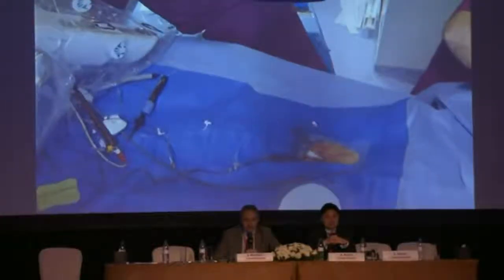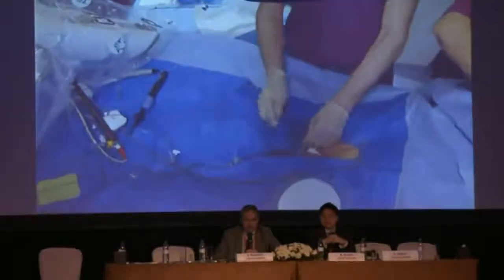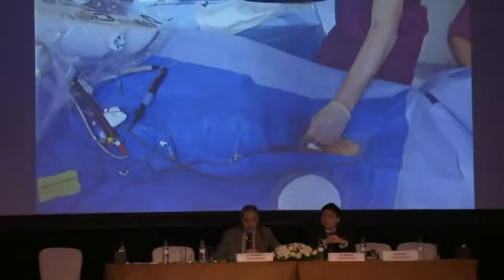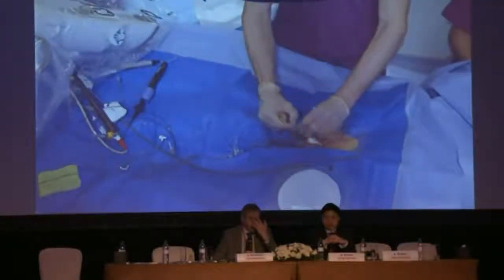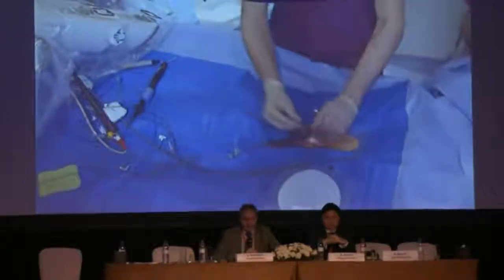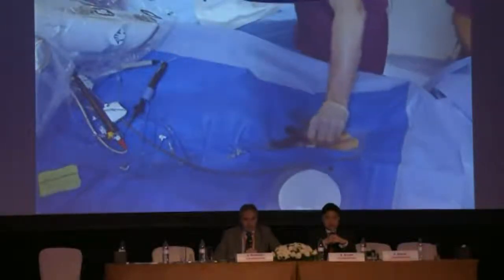And I would generally just try and characterize the areas that were really fast and ablate them as I go along. So I'd look for those type 1 electrograms that are almost continuous and fast, and pick those off in every area of the atrium that I could find. I try to avoid the anterior wall wherever possible, or at least avoid doing a lot of ablation on it, simply because I know that's the most contractile part, and I don't want to get rid of all their atrial transport.